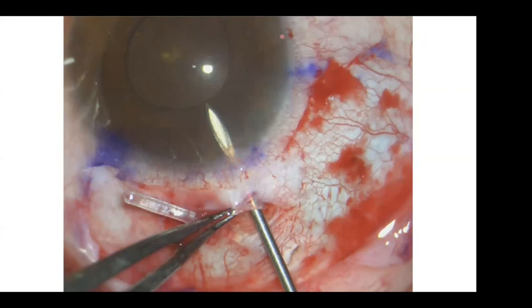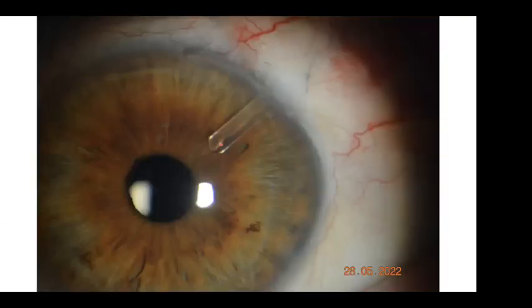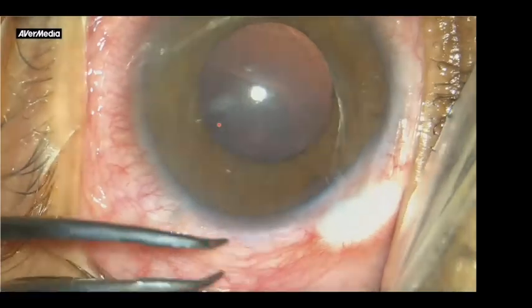Alternatively, you can make a paracentesis and inject Healon. At the time of the implantation, I don't want to lose the anterior chamber. Either I inject Healon in this area in particular to make it deep at the time of insertion of the tube, or I just take the needle on Healon. And that could be enough length. It is 2.5 to 3 millimeter. I like to measure the distance as half the distance from the limbus to the pupil. This one is slightly longer, but I'll be satisfied when it is half the distance on the surface of the iris.